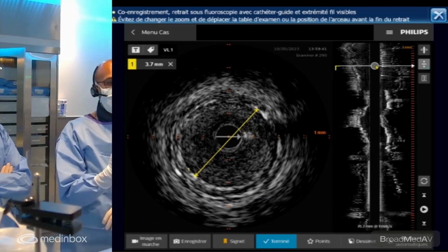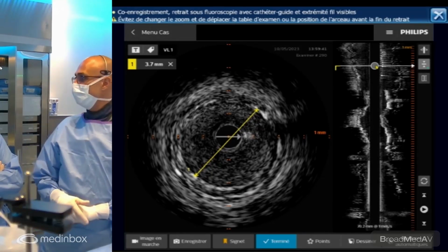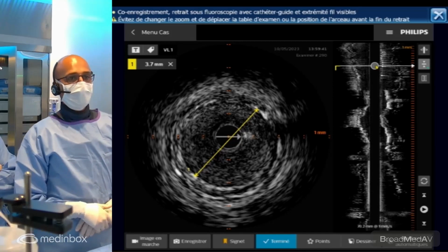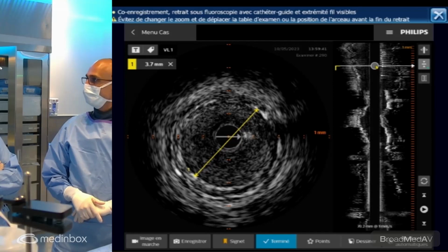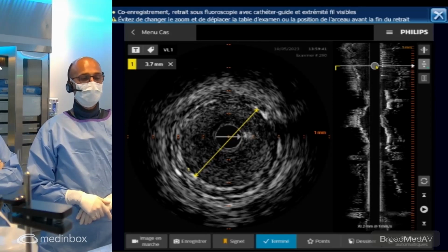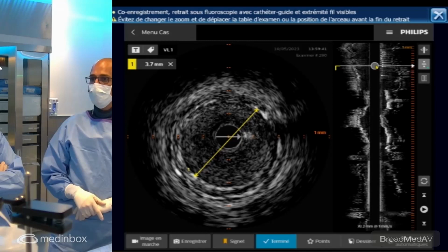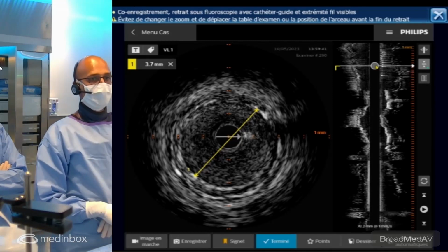And I think this is key here, using imaging when dealing with extensive calcification and you start doing plaque modification and advanced techniques. Exactly. And if the balloon opens properly, that means that the stent is going to open properly. If not, then we can debate whether to use another size of burr or go with IVL directly. Yeah, for sure. Combination therapy here would be a choice if we have issues. 15, please.